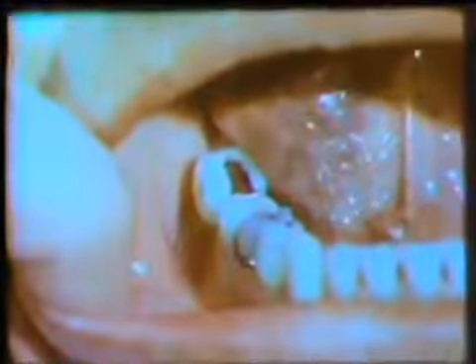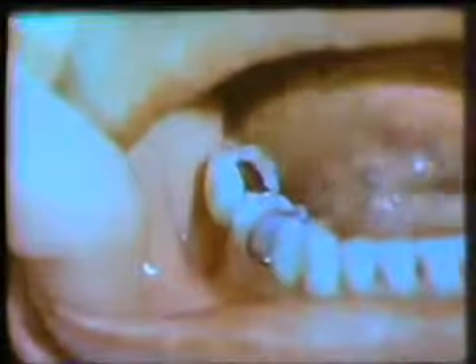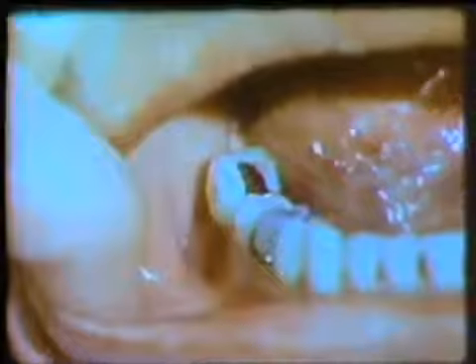However, there are certain disadvantages. These include no adjustability of the rigid retentive component, and little tolerance for error in the casting. Well-prepared occlusal and cingulum rests are essential, and there is the potential that some patients may object to a removable appliance.